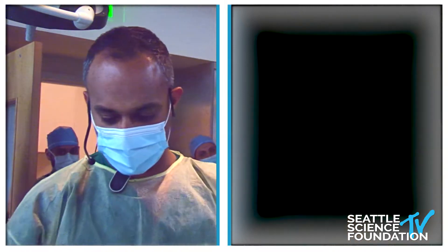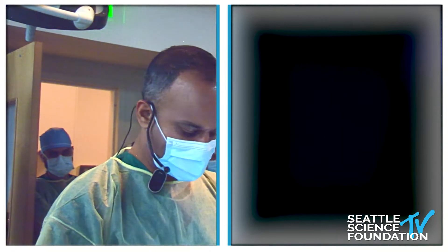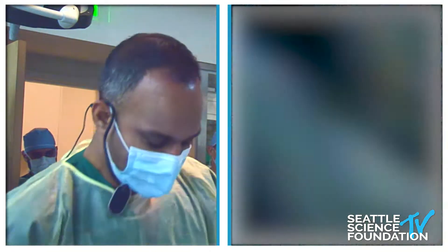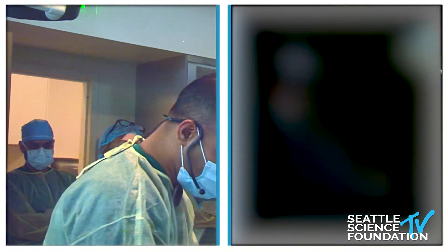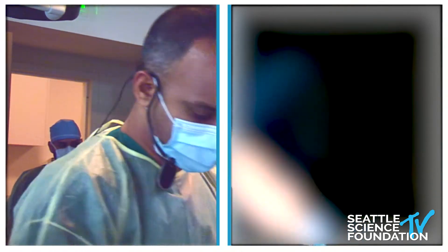Let's switch over to the angled scope. I'll take that 70 scope — put the rad 90 on and the 90 fusion — I don't need it on suction. Winston has showed us all that anatomy. What's the difference when you look with a slightly angled versus exaggerated angled scope? I think that might be nice for us to just see.